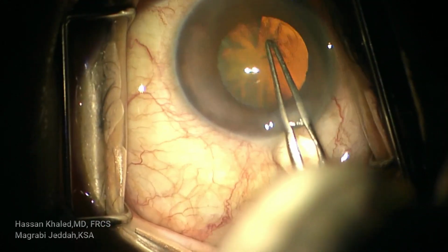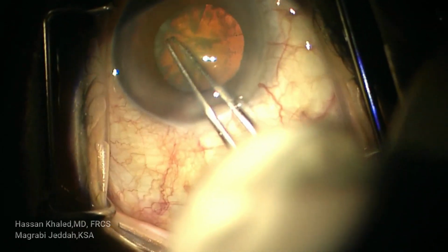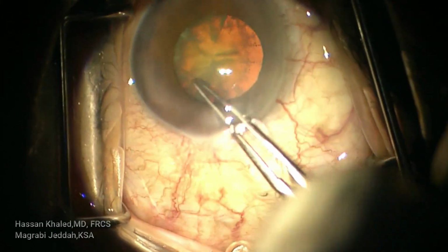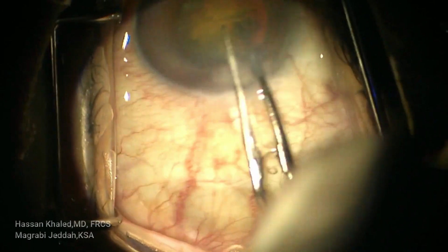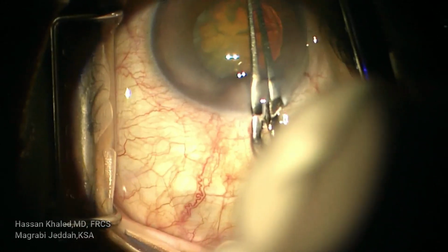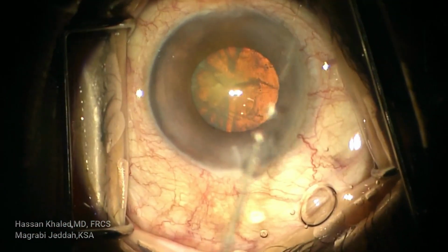So it's very important to do viscodilatation before starting the rhexis. But how can we do that? Don't fill the AC with the dispersive OVD, just inject the dispersive OVD at the level of the pupil border, then you can push it and dilate it, and you can continue your rhexis as usual. You can see here the rhexis is about 4.5 to 5 millimeters.